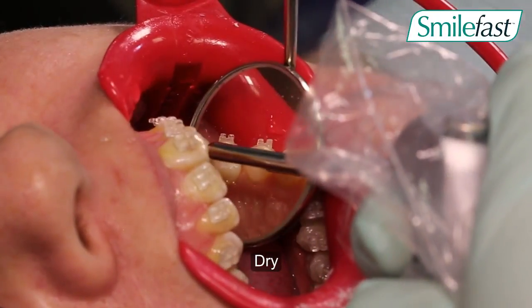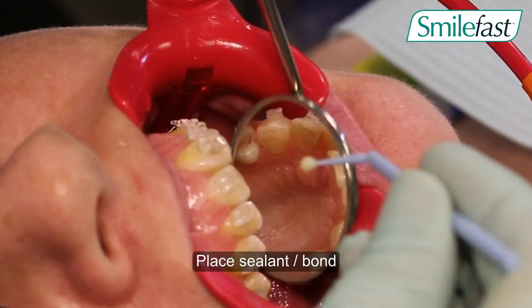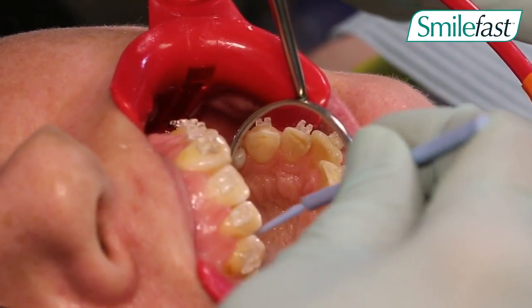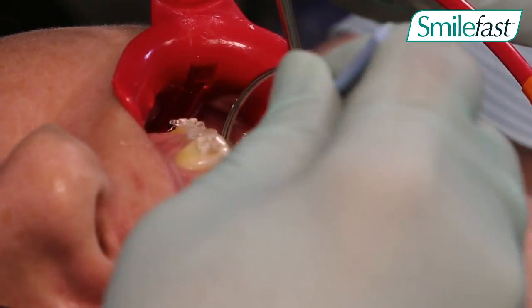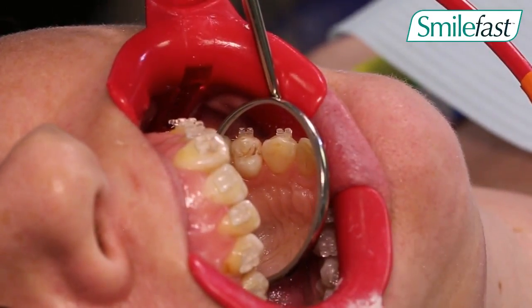We do a normal rinsing procedure, we air dry, and we place our bond or sealant such as Solo on those particular teeth.